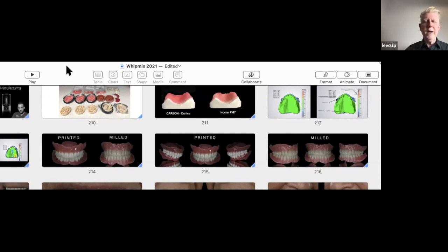We've got files going. Matt may do it after 7 years, I think, but we archive the files because your system will get bogged down, and we do 20 cases a day, so ours can get bogged down real quick. So at the end of so many months, Matt will take them out and put them in our server archive, but they're still there because John may be doing an implant case and say, hey, Lee, I need a whatever.